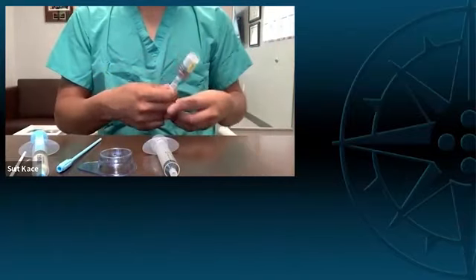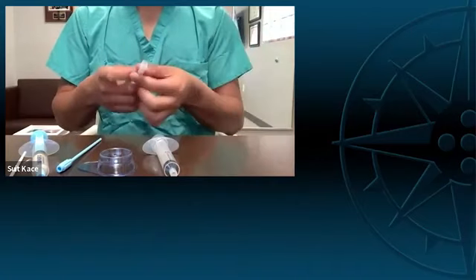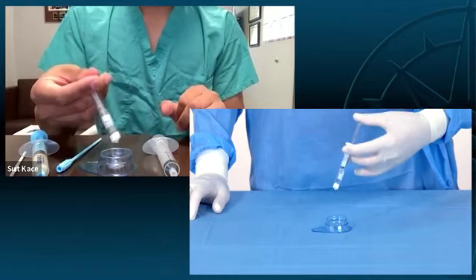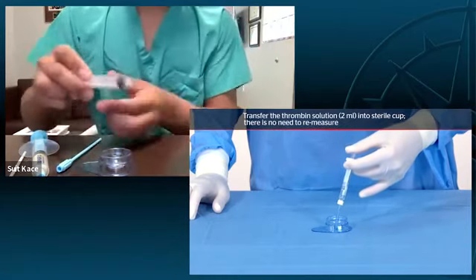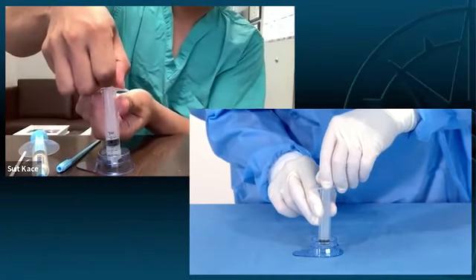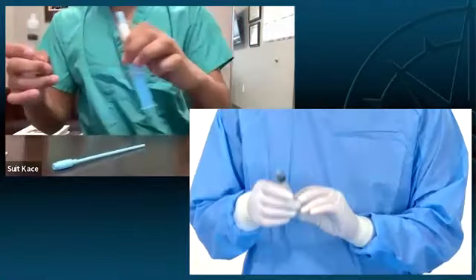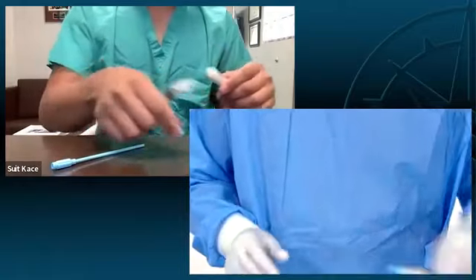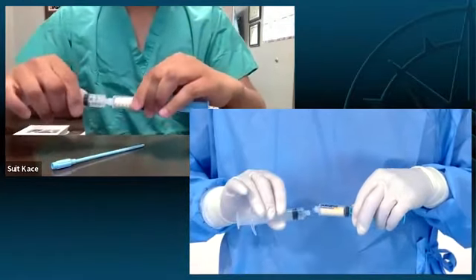So now we're on the sterile field. Your scrub person receives the thrombin from the circulator, and your scrub person will draw it up into the syringe. It's got every drop. Okay, and unscrew the end of the gel syringe, connect them together.